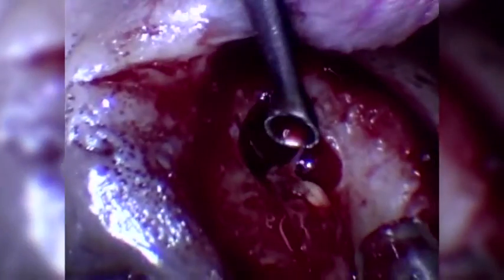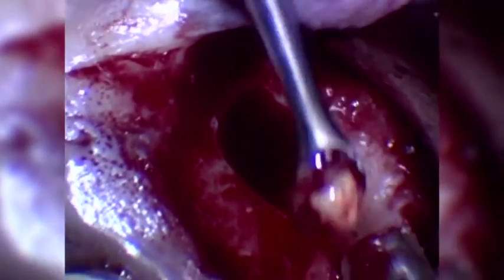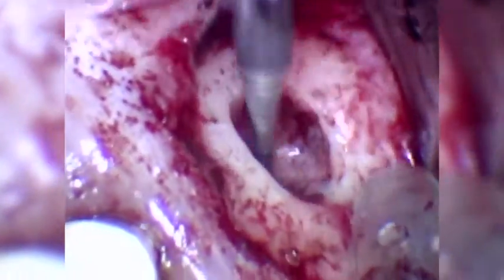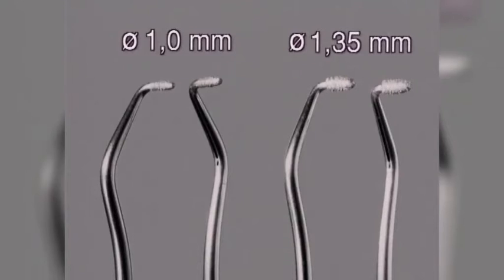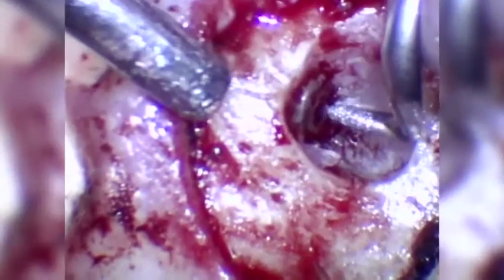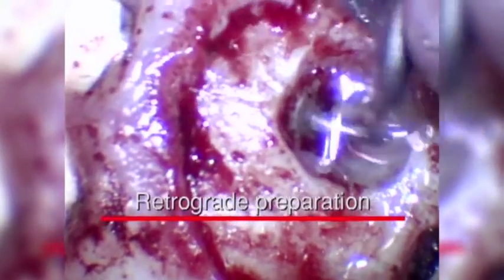Curettage of the apical tissue. Notice the small buccal opening, which does not have to be enlarged during the resectioning or retrograde preparation. Resection of the root apex with a flat fissure burr. The correct preparation tip is chosen according to the quadrant and size of the root tip. Introduction of the SonicFlex retro preparation tip. The correct level of sterile coolant irrigation is determined. Control of the axial angulation of the tip.